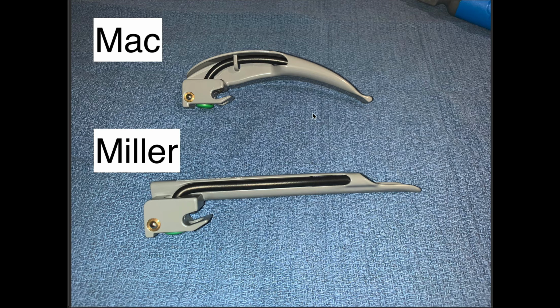In the videos I'm going to show you, we'll look at the, quote, traditional way of using a Mac, but then we're also going to see a video where the Mac blade is used to lift the epiglottis, and a view where the Miller blade is put in the vallecula, and you can see the epiglottis. So there's nothing set in stone about how these are to be used. But it's good to know at least the names: the Mac is the curved blade, and the Miller is the straight blade.